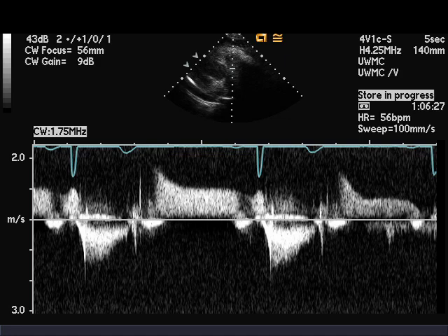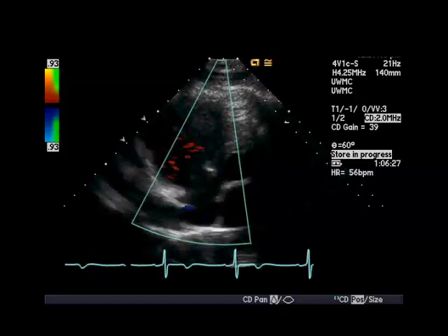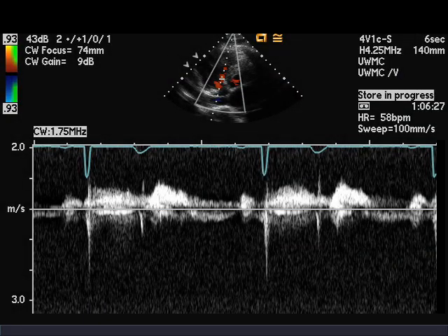Using the continuous wave Doppler mode, the diastolic curve of pulmonic regurgitation is seen in addition to the antegrade flow velocity curve. The tricuspid valve is evaluated with color Doppler in the RV inflow view, with visualization of the very small regurgitant jet assisting in recording the continuous wave Doppler velocity signal.